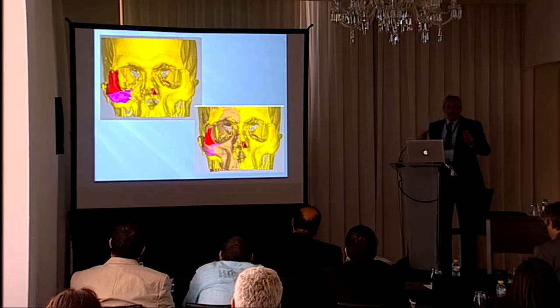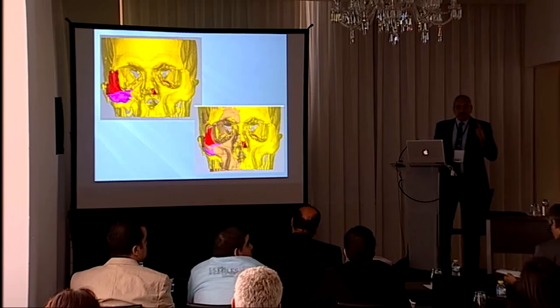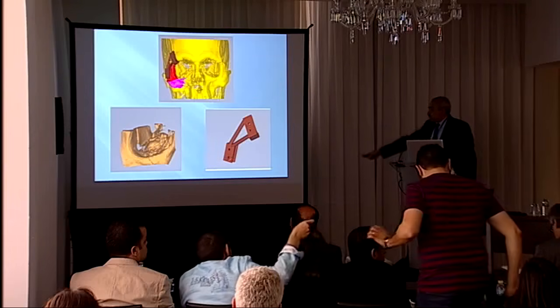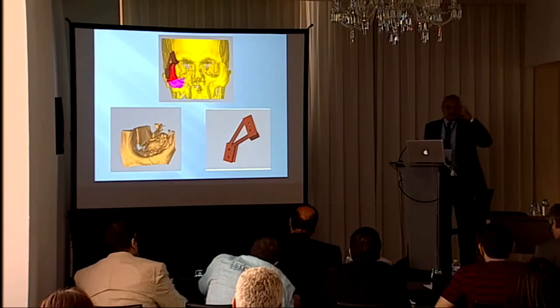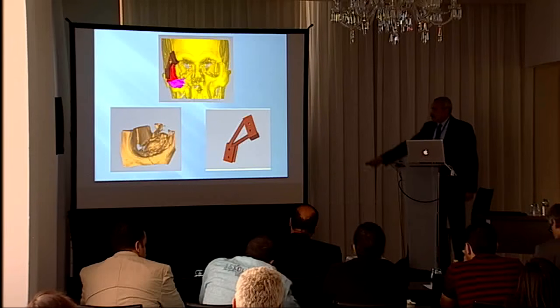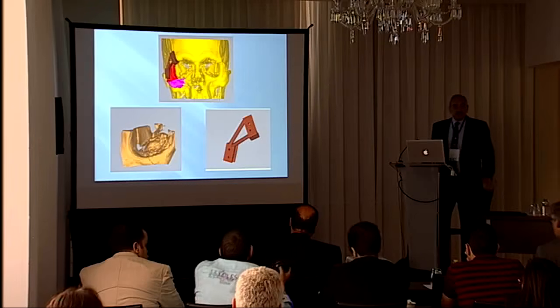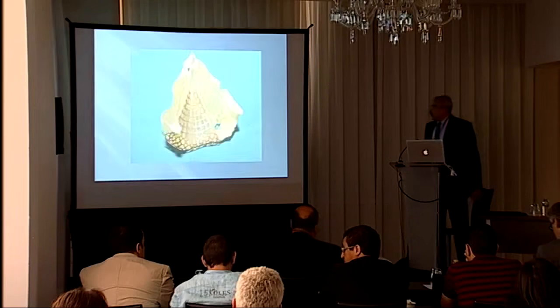Then we start putting the puzzle in place inside the zygoma, so as to end up with right and left identical zygomas, and we fabricate a series of stents that would fix the bone in the desired position. I also printed in 3D the orbital floor to make the orbital mesh contouring before the surgery.